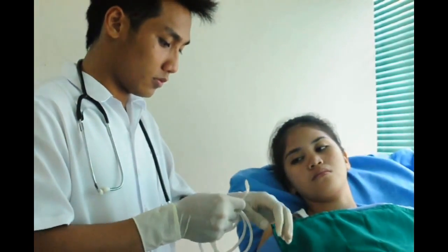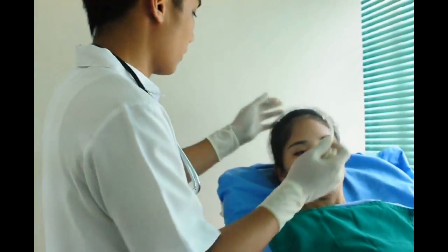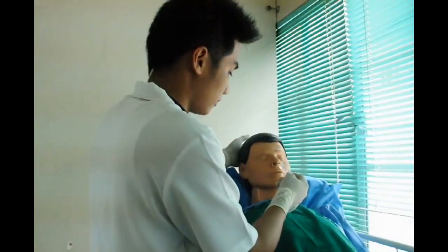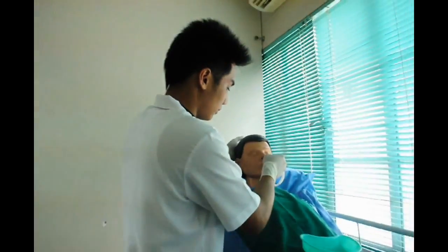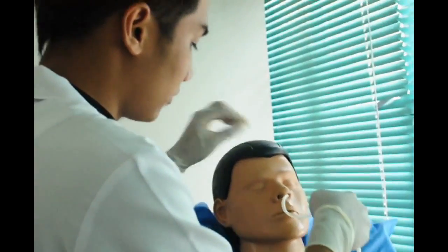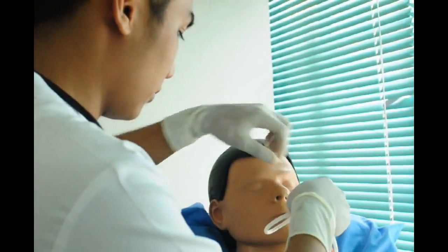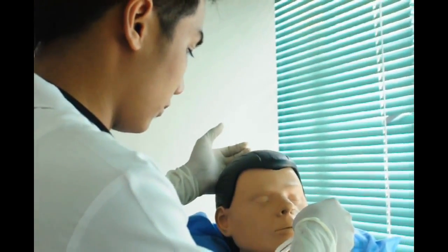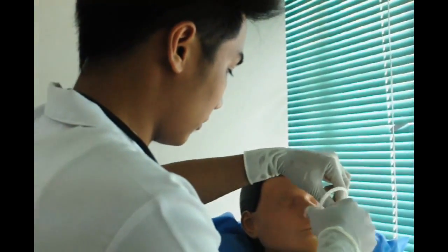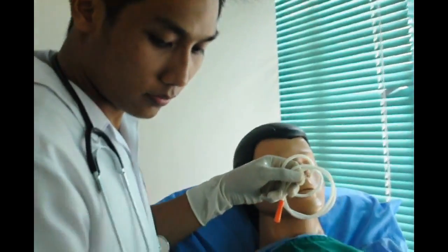Ask the patient to slightly flex the head back against the pillow. Gently insert the tube into the nostril while directing the tube upward and backward. Following the normal contour of the nasal passage while inserting the tube reduces irritation. When the pharynx is reached, instruct the patient to touch chin to chest. Swallowing helps in advancement of the tube. Encourage the patient to sip water through a straw or swallow.